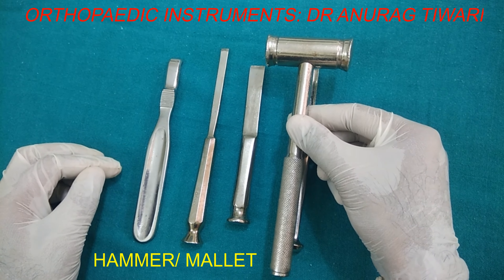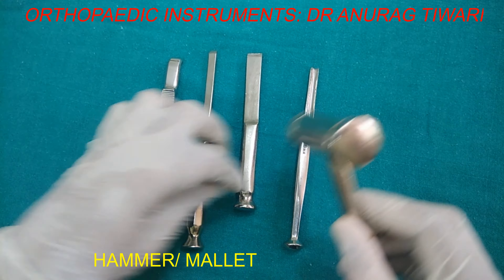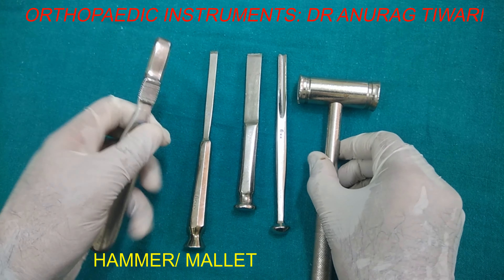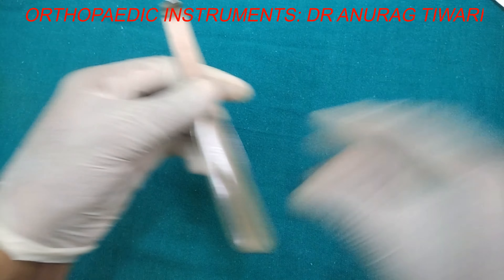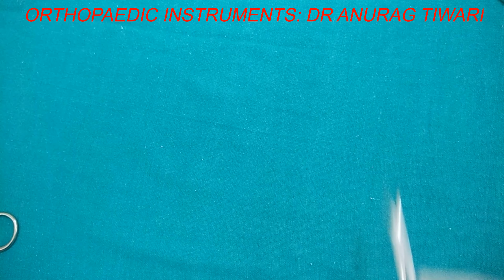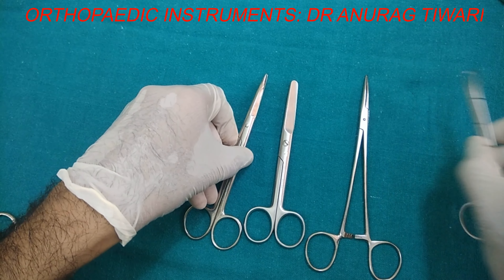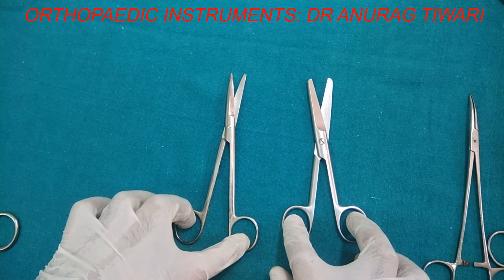The Steinmann pin and Denham pin are used for skeletal traction. We insert this into the bone and apply traction to the bone. The purposes of traction include: alignment of fracture ends, reducing muscle spasm, reducing pain, maintaining alignment, and maintaining length. There are two types of traction — skin traction and skeletal traction. These pins are mainly used in skeletal traction, which can be fixed or sliding.